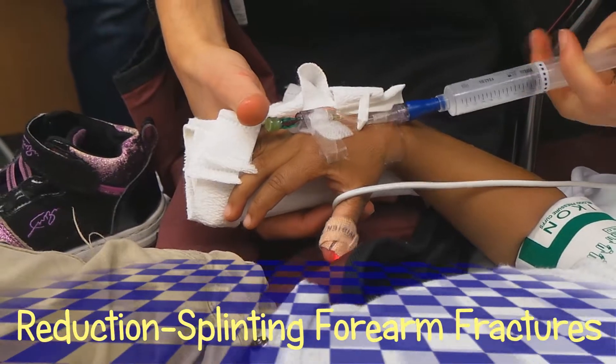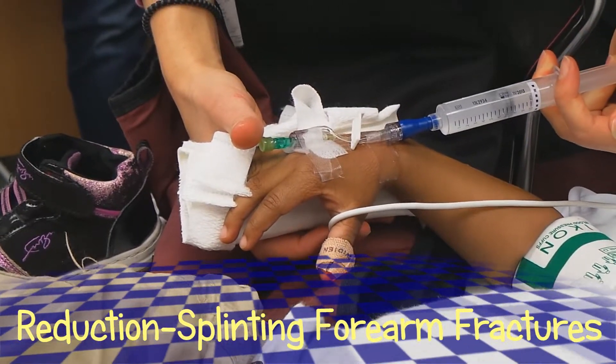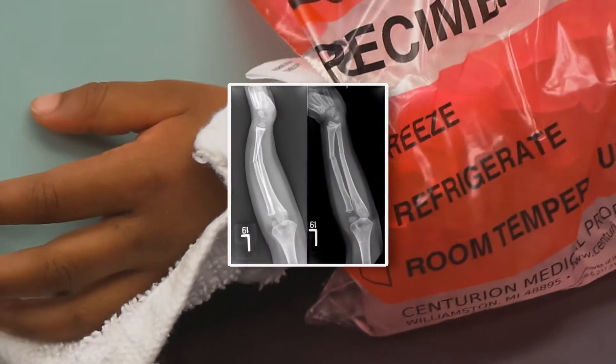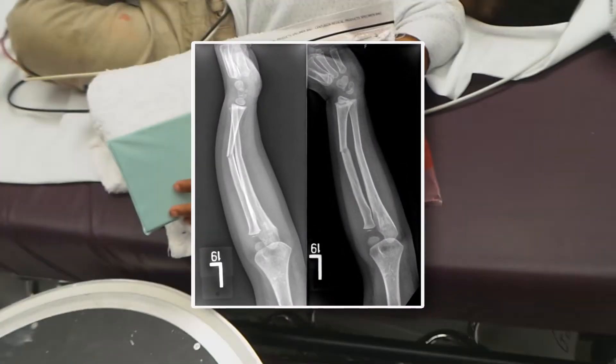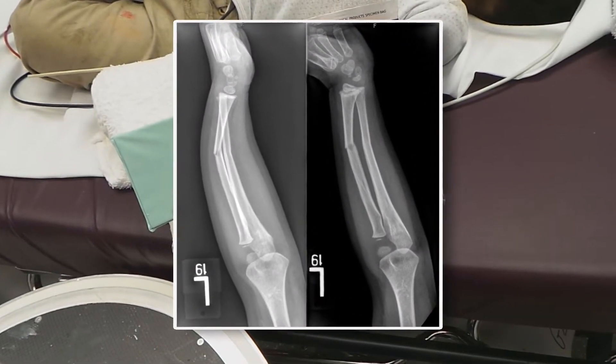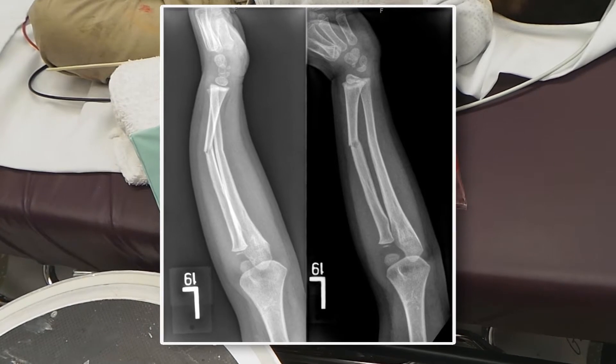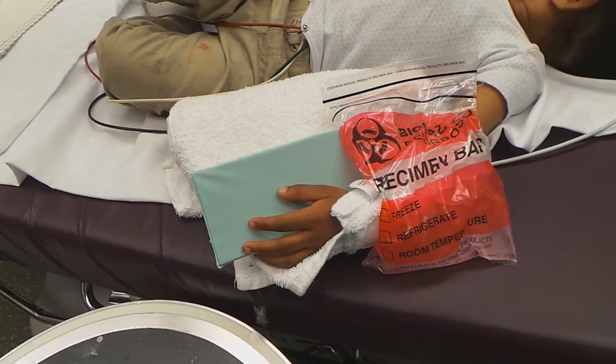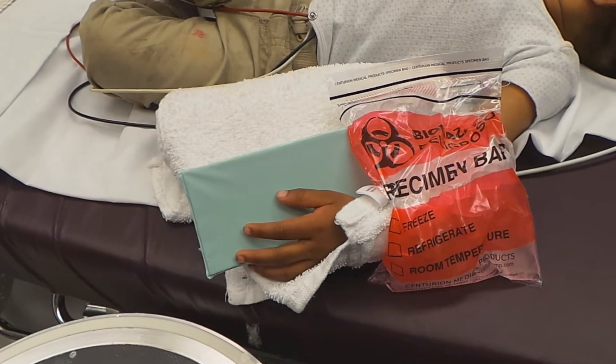Checking the IV out, and then we're going to be doing some ketamine — about a milligram per kilogram. This little girl has fractured two bones, kind of mid-shaft of the radius and ulna, after she fell today. We did the timeout; timeout's done. Okay, you ready for the ketamine? We're ready for ketamine.